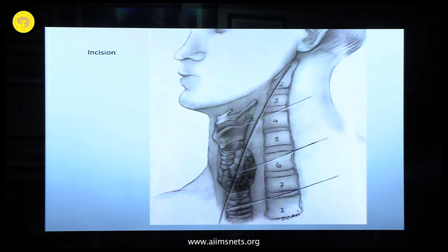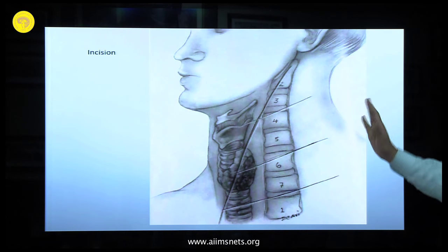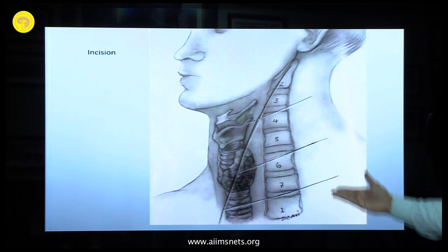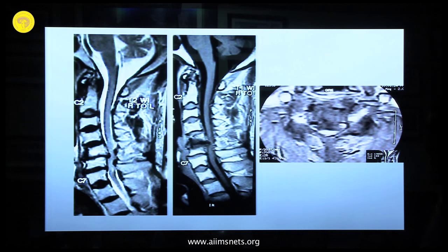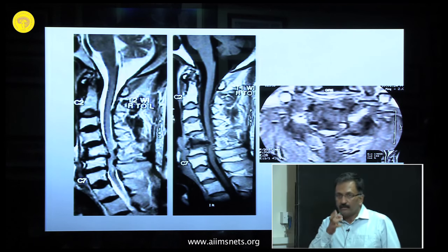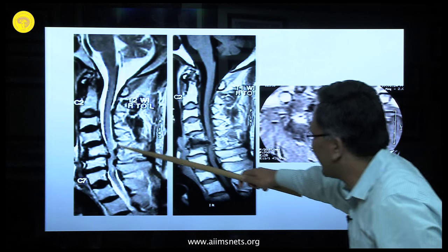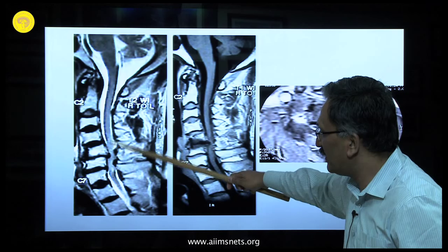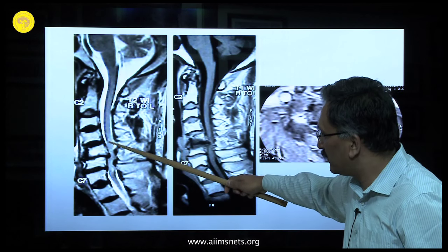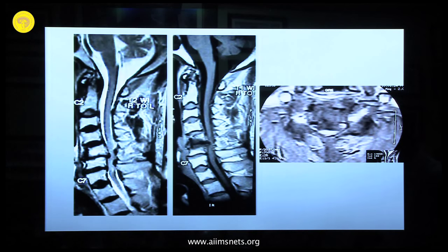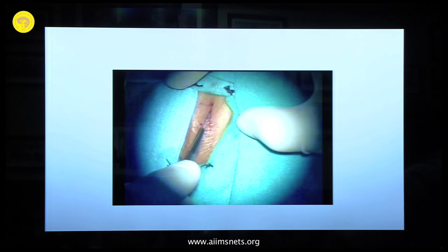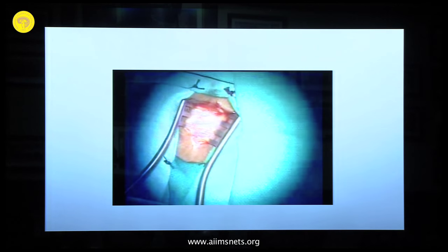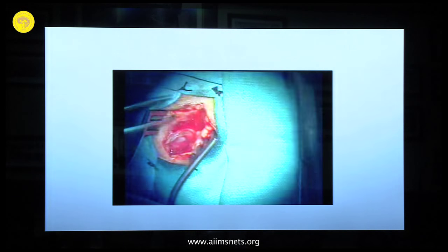Regarding incisions, we all know these classical levels — thyroid, trachea — you can palpate them. I will show you a video of the operative steps. There is a single corpectomy here with two-level compression, and the cord is completely narrowed. A very small incision is used — you do not need a long incision because you can undermine the edges and get a very good space. You seldom have to use a vertical incision. A horizontal incision is enough.